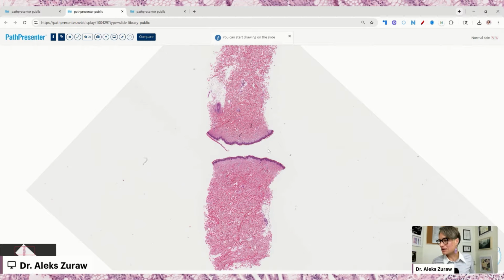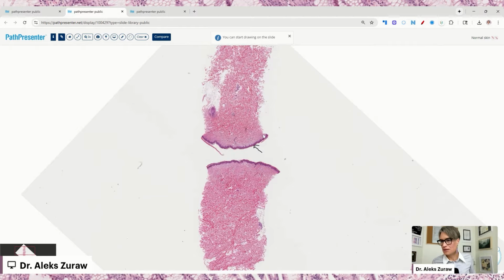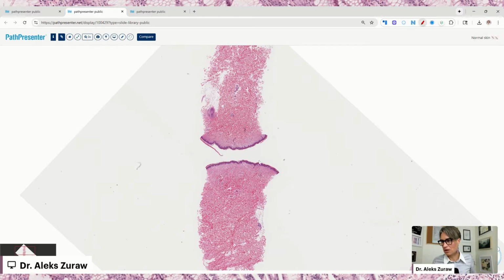And you can already see that this here is a lot darker. This is a certain shade of pink here and a different type of pink, and a lot looser here, right? So we have these three different layers, right? That's what they're called officially. And again, this is the outside going to the inside of the body. So from the outside, we always have something that protects us. This is the barrier. This is the thing that is going to be keeping germs, keeping stuff from going into the body.